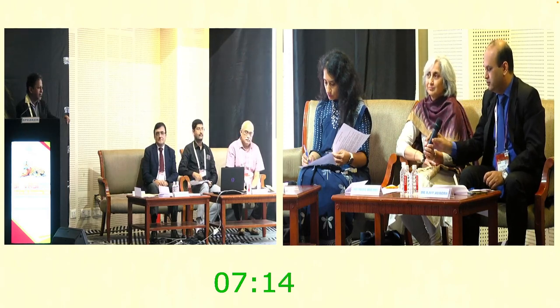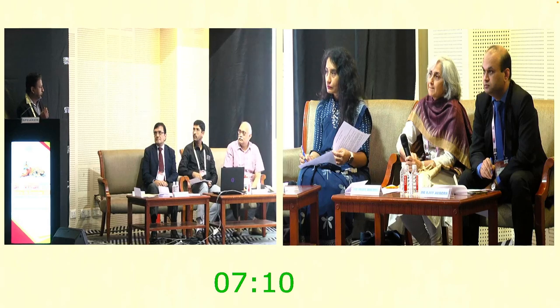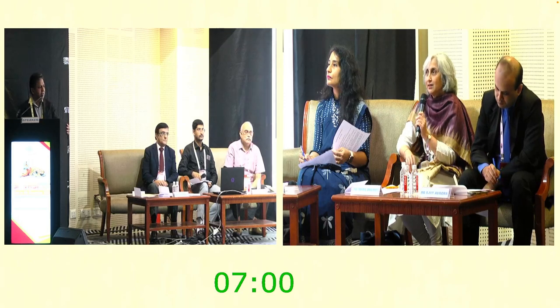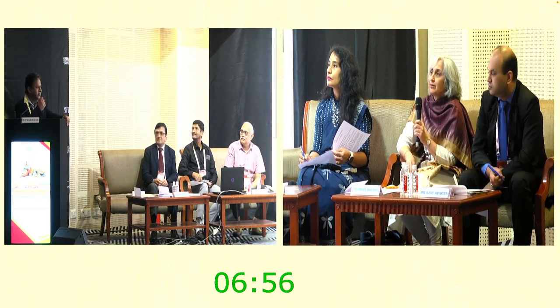Another advantage is because it's connected with the handle, that can be connected to the infusion pump. So the needle you have to connect directly to the infusion, and then holding it will be very difficult. Nice, Sangeet. Where can one get this? Ma'am, this is available with the Epsilons.